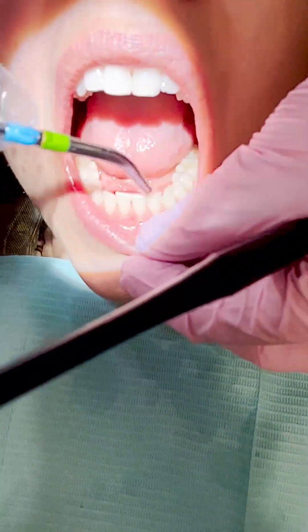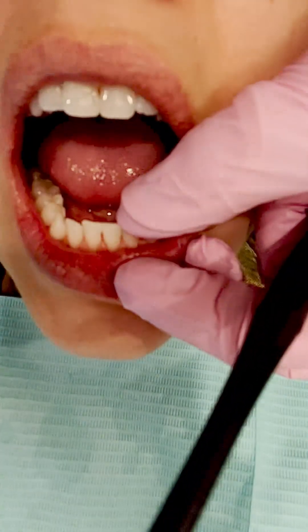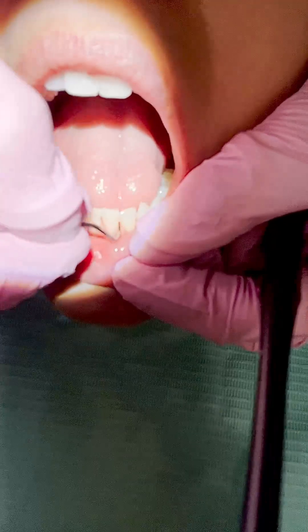Now I'm blowing air again. It's basically a dance of blowing air and scaling — back and forth. You don't need to scale just to scale. That's how you notch out the teeth and cause actual damage to the enamel. So blow air, and if there's nothing there, there's nothing there.